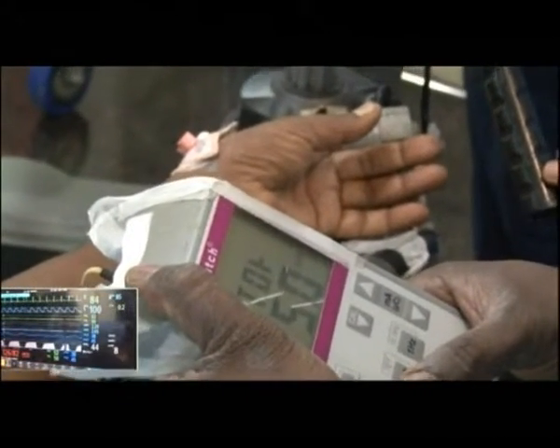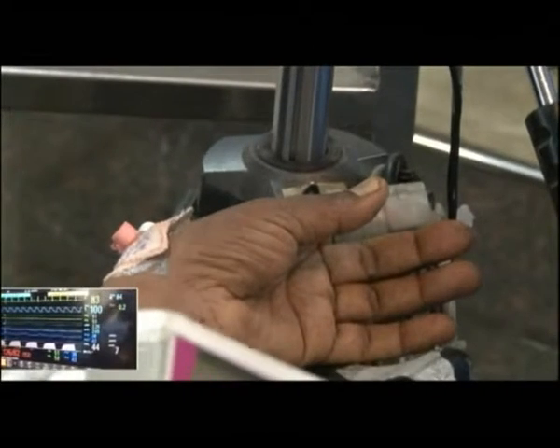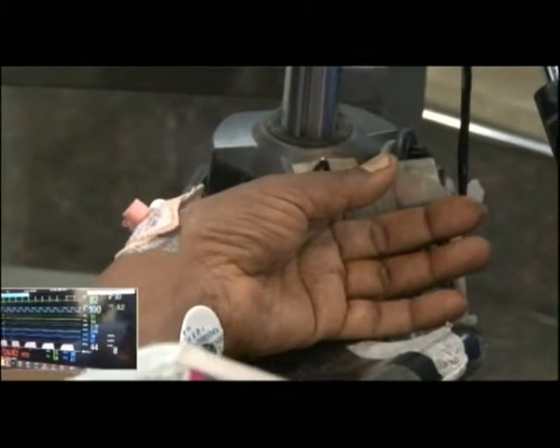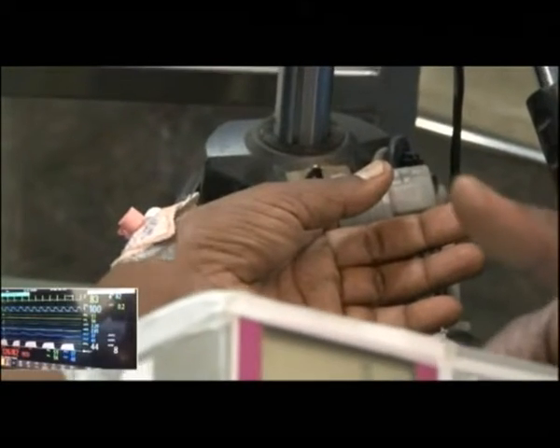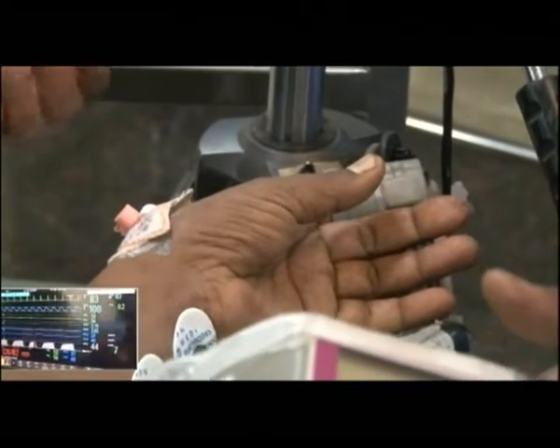Train of 4 response. So if you see the twitching, you have the fingers twitching. What I'm looking for actually is the thumb twitching. Many times you have the finger twitching and we say, oh, patient's back, but that is actually a wrong response. So I'm looking for the thumb, the adductor pollicis movement. And once you get that, you know that's the twitch you're looking for.